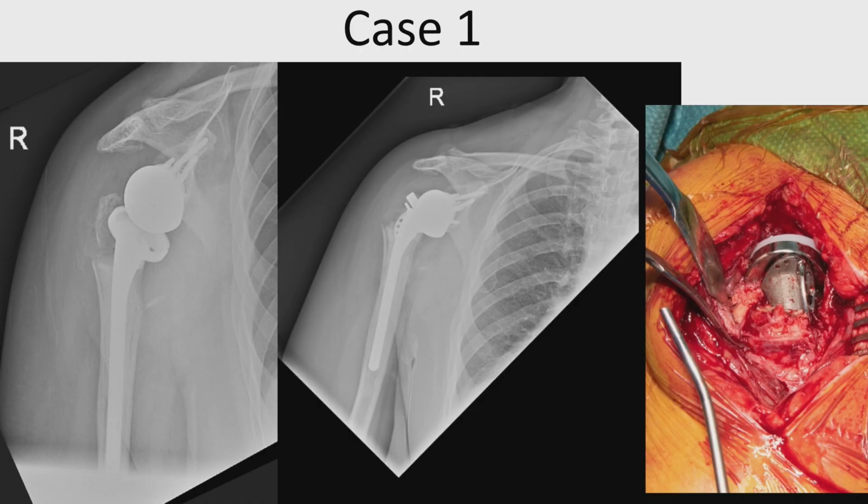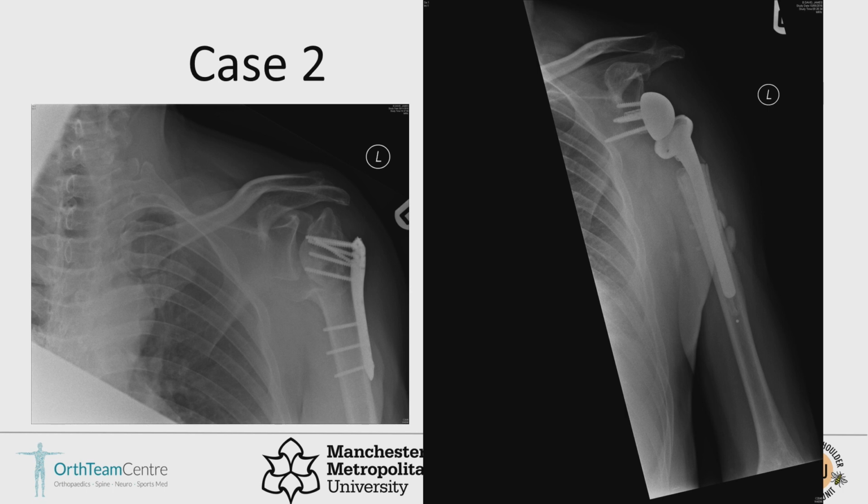Just a couple of cases before we finish. This is a probably poorly done fracture reverse. The tuberosity is migrating and then dislocates. And at the time of surgery, she had a cam effect on the tuberosity fragment at the back of the humerus. We did some simple manoeuvres, excise that, change it to a constrained liner, and she was stable.